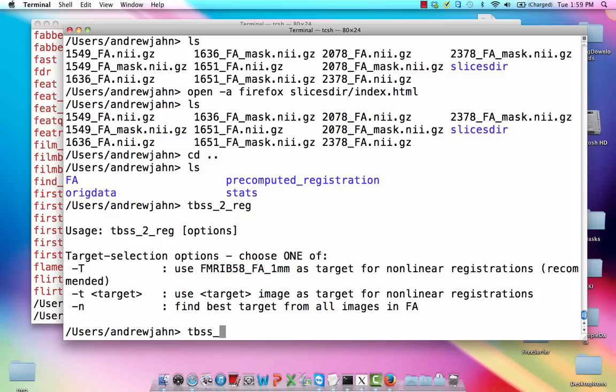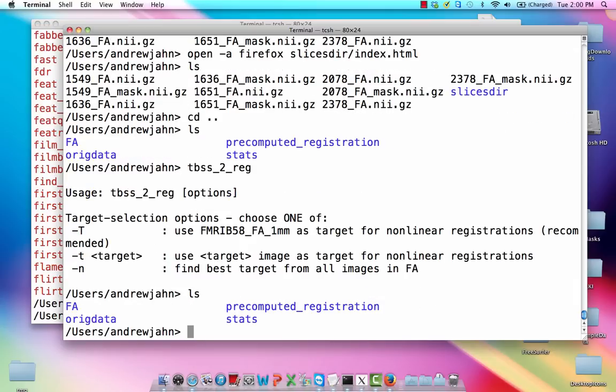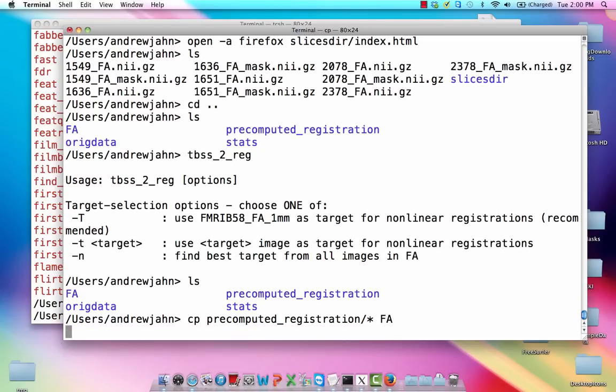Okay. So if I were to run that, I would just do this, hit enter, and off it would go. However, that takes a long time, and it's already been pre-computed. So we're just going to copy everything in this pre-computed registration folder and put it over into that FA folder. So just as if we had just run that step right now.